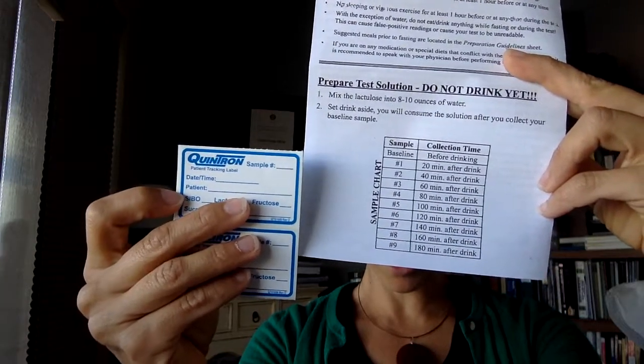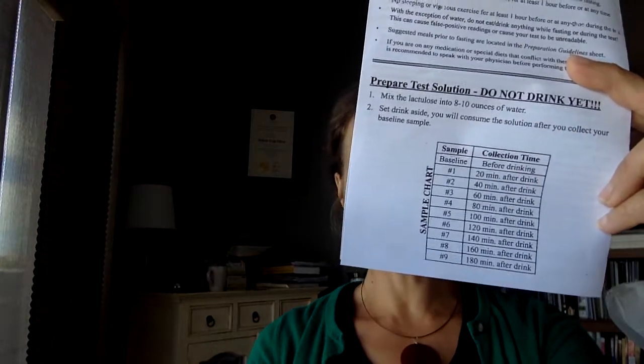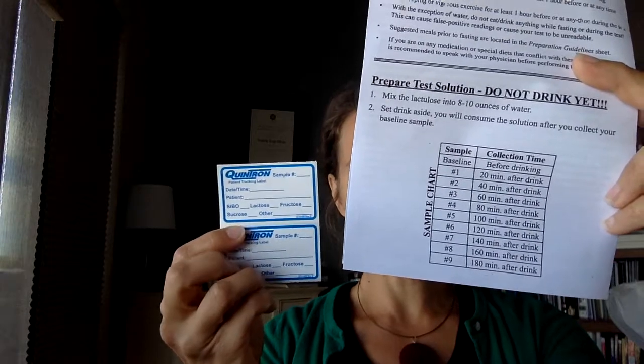Don't worry about filling out the bottom part of the label. After the baseline, the next one would be 'sample one' — that is what you would write in there — and then of course the time that that sample is taken. The date would be the same, and then your patient name. So I'll demonstrate how to do this test.